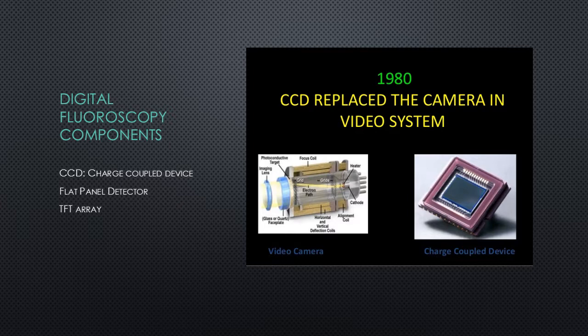Does this sound familiar? The indirect capture system can use the cesium iodide as its scintillator, or sometimes gadolinium oxysulfide, but then the amorphous silicon is the photodetector, and it's basically painted on a substrate material like glass. The TFT operates the same way as it did in static digital imaging. In digital fluoroscopy, the image receptor is 20 by 20 or 40 by 30. Sometimes it's 40 by 40. Images are acquired rapidly in frames as high as 30 frames per second.